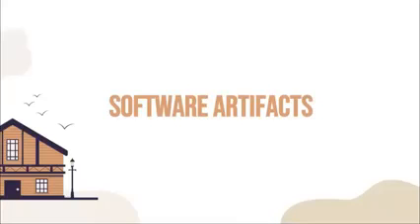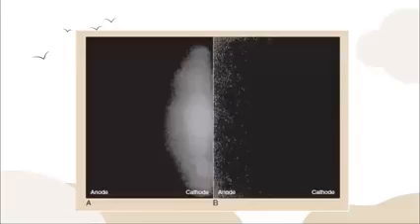For software artifacts, ayan. Okay, here's one example. Irradiation of a digital radiographic imaging receptor by the raw X-ray beam may show variations over the image, producing an irregular pattern that could interfere with diagnosis. So pag ana ang gawas, ang cause, raw X-ray beam, diretso siya sa imaging receptor.